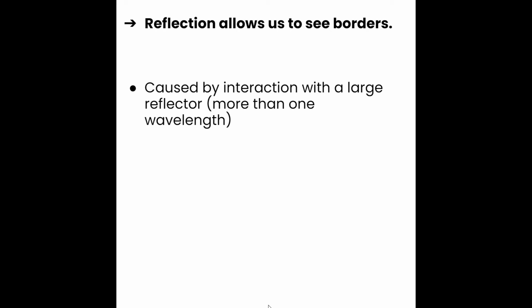So scattering sent sound all over the place, reflection will typically send sound back towards the transducer. So we get more echo information back at the transducer, which results in crisper, stronger echoes. Also, just like scattering, reflection is going to take some of that sound energy out of the beam, which will slightly attenuate it. But if we didn't have reflection, then we wouldn't have ultrasound pictures.